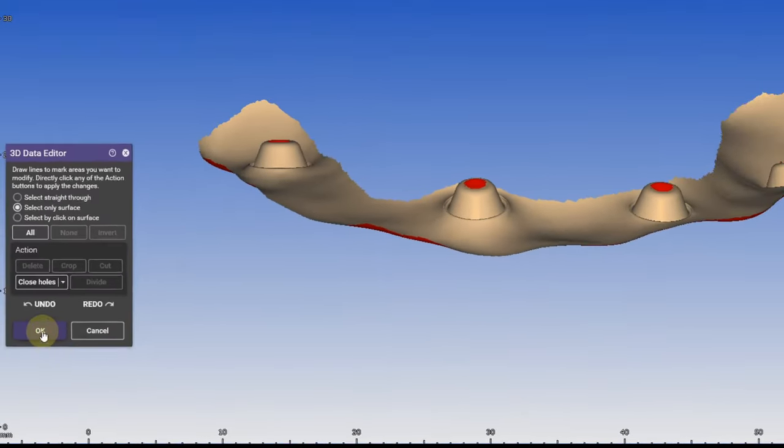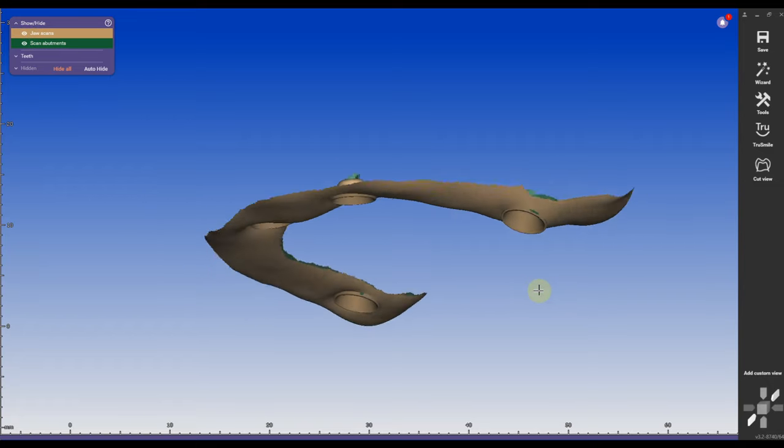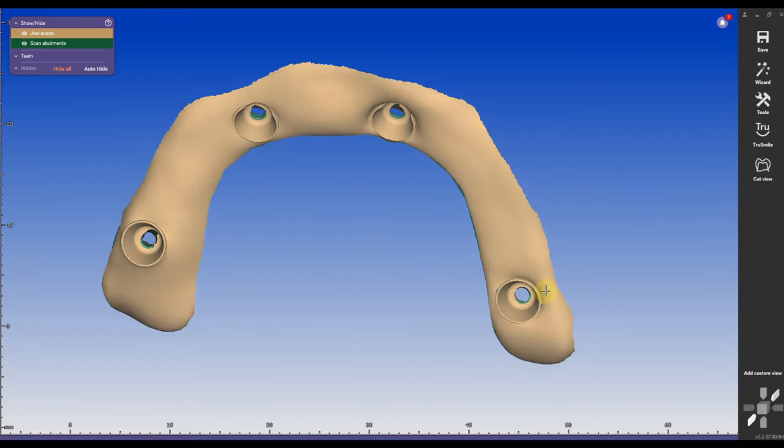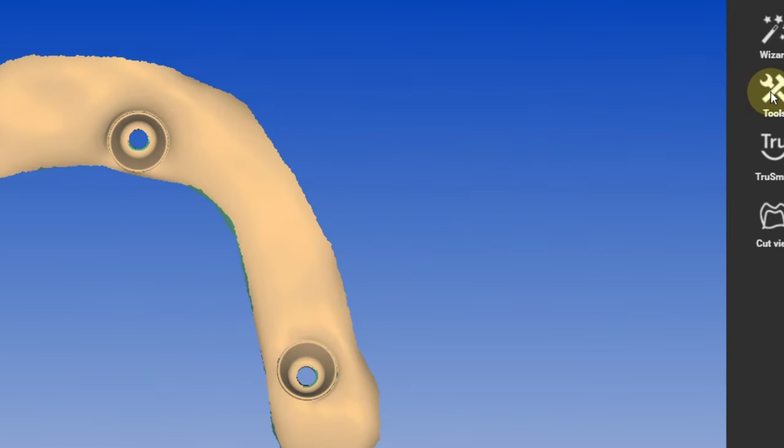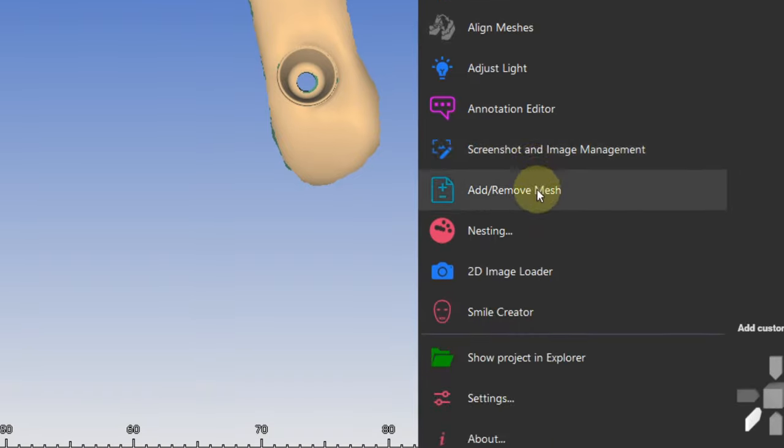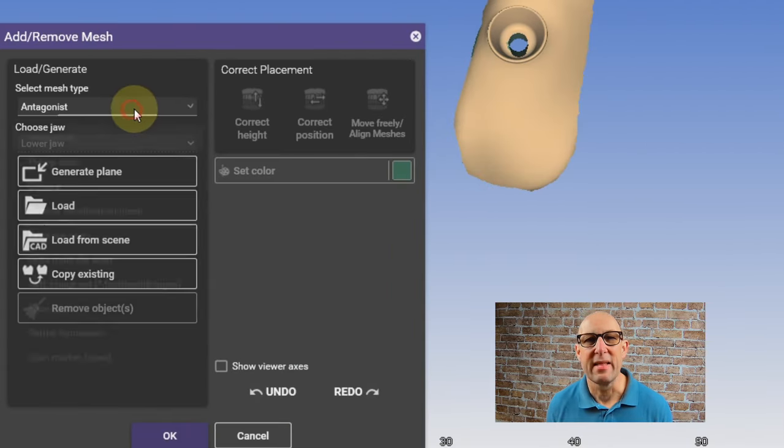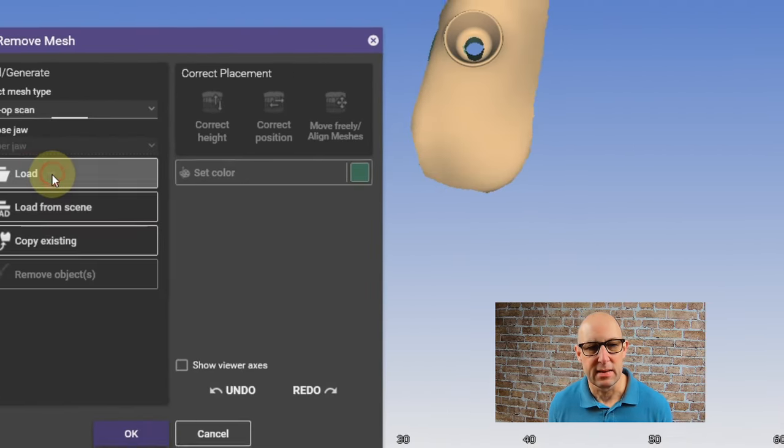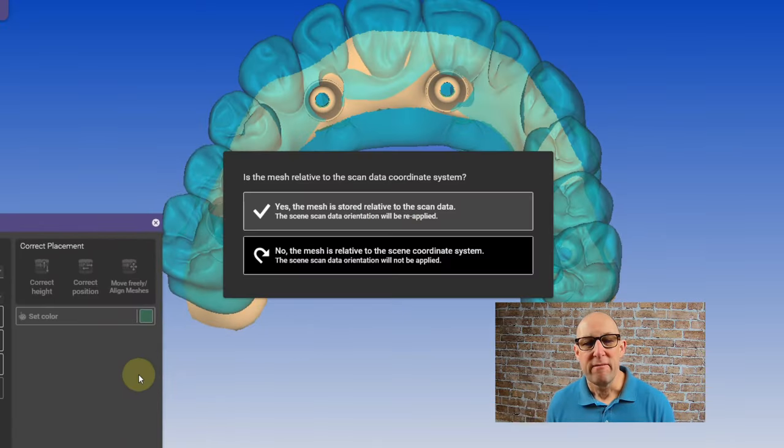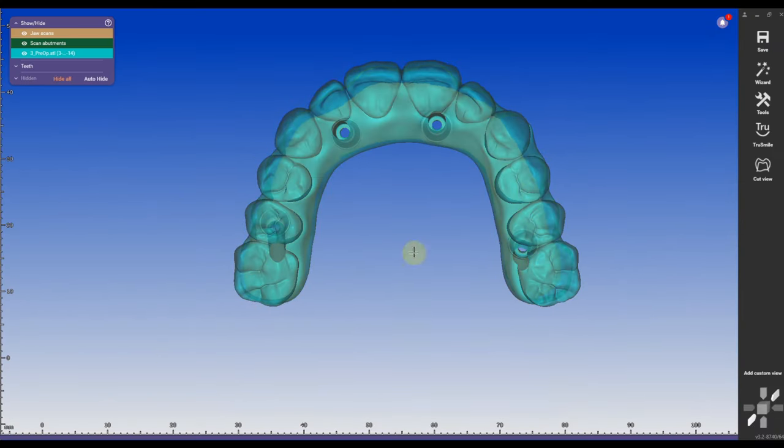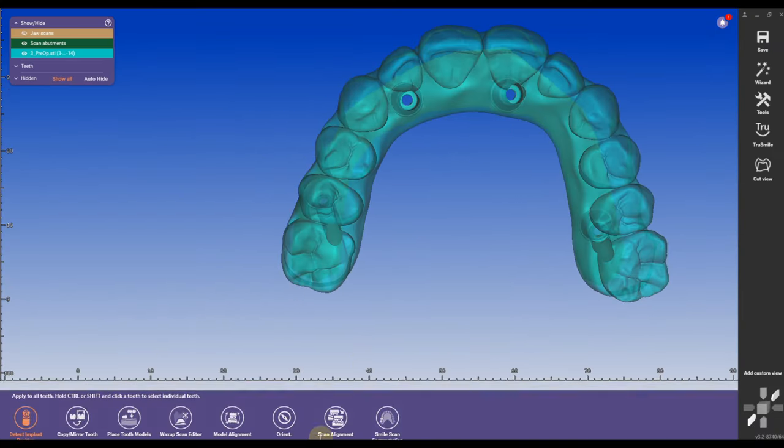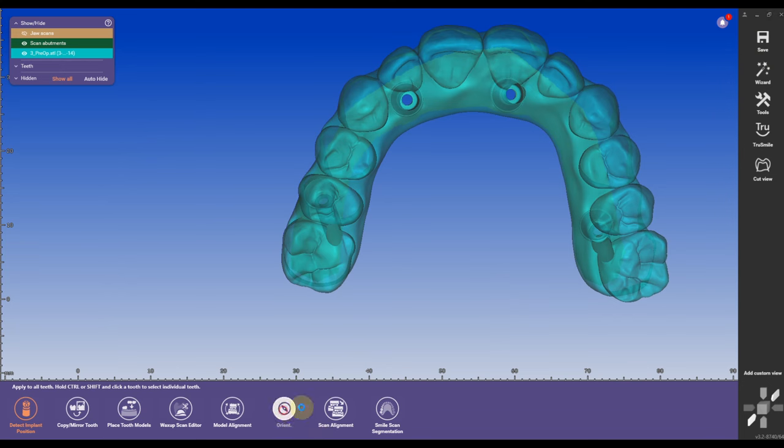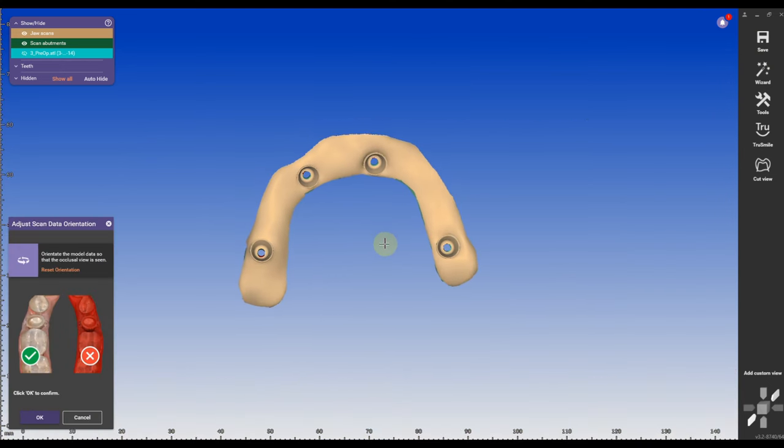Now comes the important part. I'm going to go to tools, add mesh and I'm going to add a pre-op scan and we're going to need this pre-op scan later in the bar design just as a guidance.